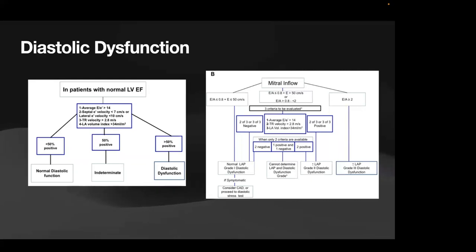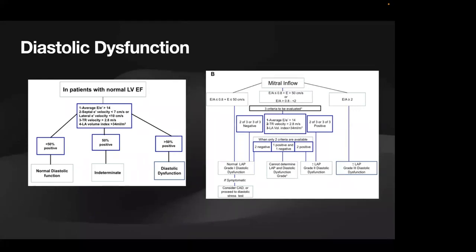So I completely agree with you. In those populations they talked about, HCM, LVH, patients who have advanced AV block, et cetera, they say exactly the same thing as you said. It's important to differentiate those patients who have a structurally abnormal heart and normal EF, and understand that they may too have diastolic dysfunction despite the fact that their systolic function is normal.